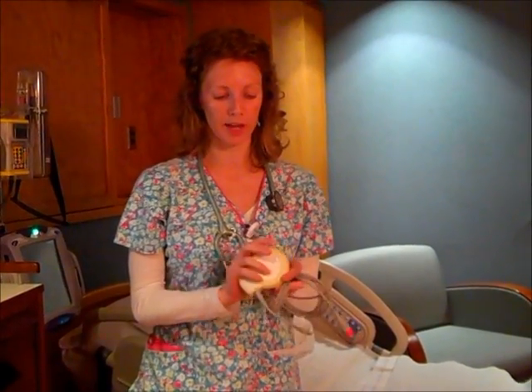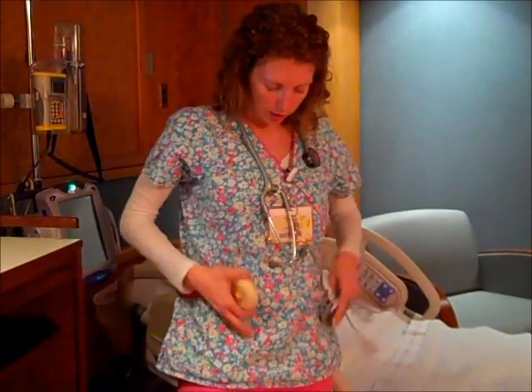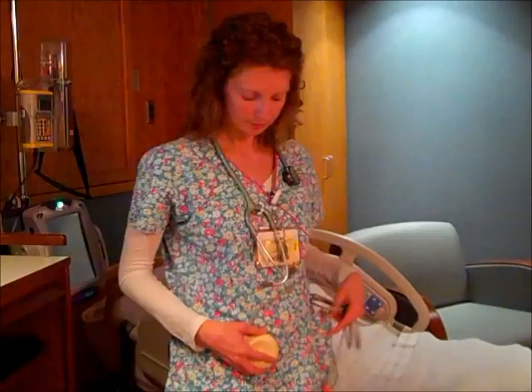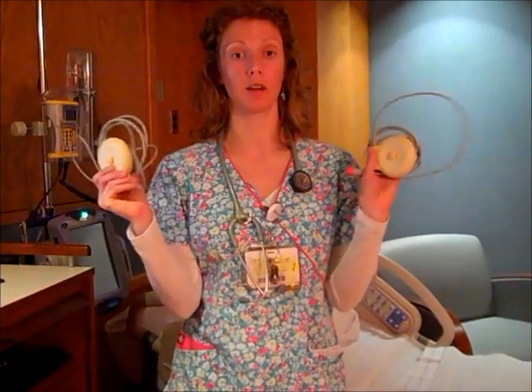Then what you'll place to get the fetal heart tracing is a fetal heart monitor. And what you'll do is you'll put a little bit of that lubrication jelly, the same thing we use for the Doppler. You'll put that on here, and then you'll palpate the abdomen with Leopold's maneuvers to assess where the fetal lie is, because you want to see where's a good place on the back so that I can pick up the heartbeat. So you've done that on the patient that's in the bed, and you will find the baby's heartbeat. Okay, and that's below where they place the toco. And then you'll attach that on. And so that's how you get this reading. And patients that are hooked up to any kind of drugs or just in assessment for labor are going to have a toco and a fetal heart monitor.